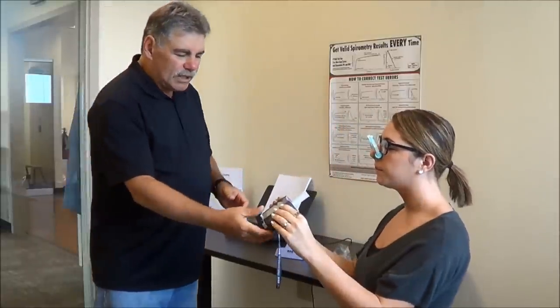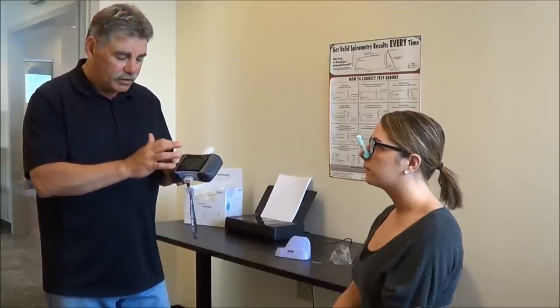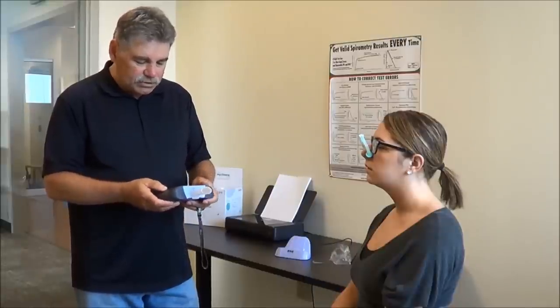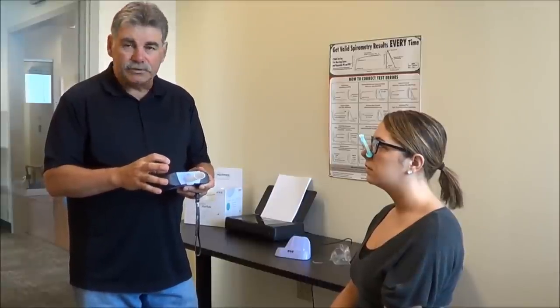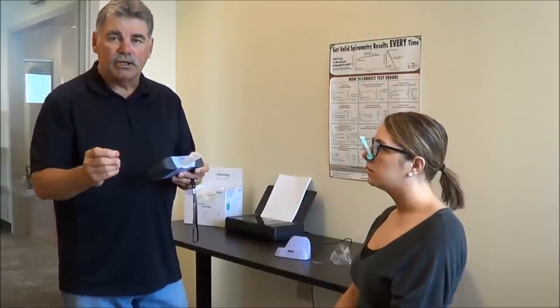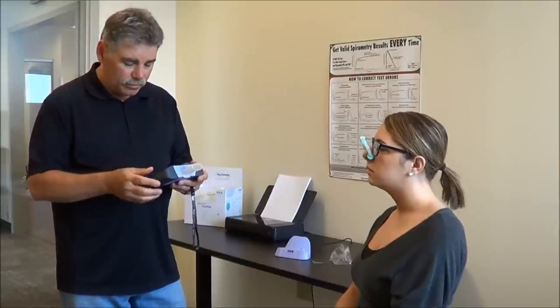Great job. Now, on the EasyOne Air, while Tina was blowing, I can see a flow volume and a volume time curve. As a technician, it's very useful for me to see the shape of those curves as she is blowing, so I am positioned in a way that I can see them to aid in seeing the quality of the test that just occurred. There's also quality feedback after each trial. In this case, it says, good effort, do next, telling me that the test met the standards for a good blast at the beginning, and she kept going until there was very little flow at the end of the test. Those are two components of the test that are quite important.